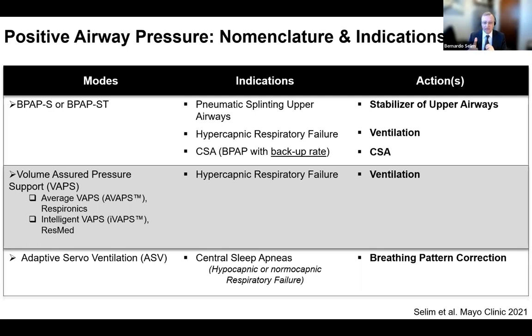And the backup rate can have the role of intervening during periods in which there is no respiratory effort, like central sleep apnea, or when the patient needs to maintain a certain minute ventilation. Just to make a pause here, minute ventilation is respiration rate multiplied by your tidal volume. So when your respiration rate is not kicking in at enough levels to maintain ventilation, then your backup rate can help with that.